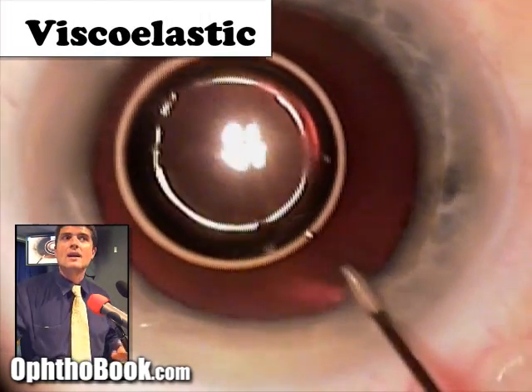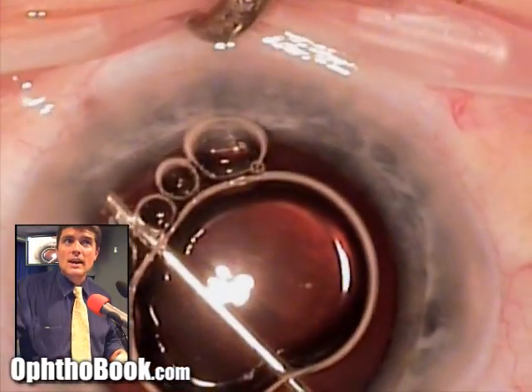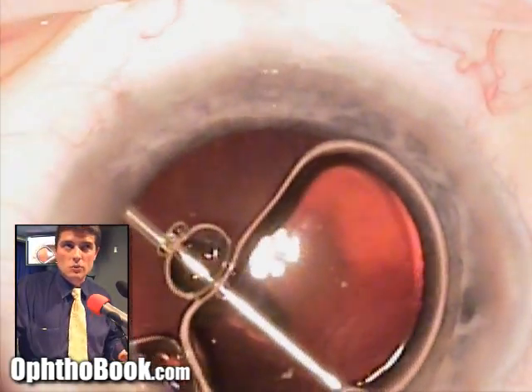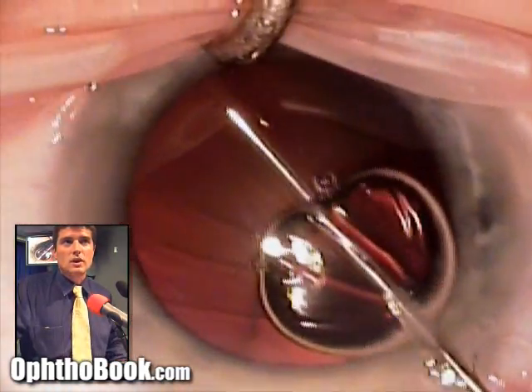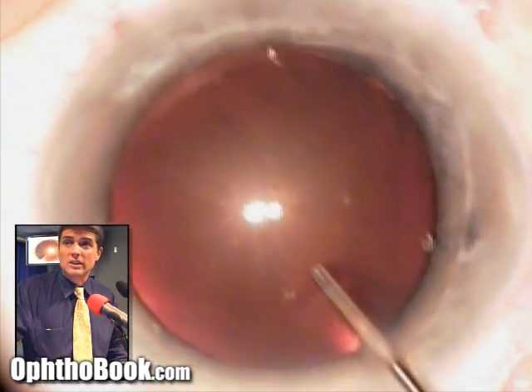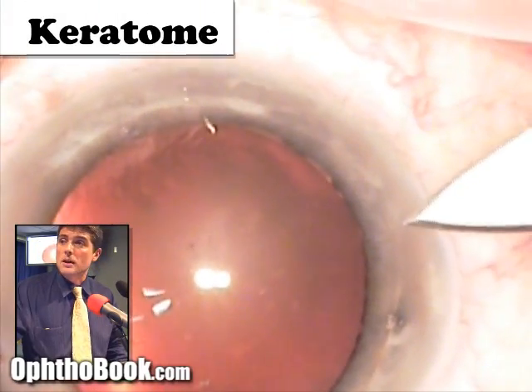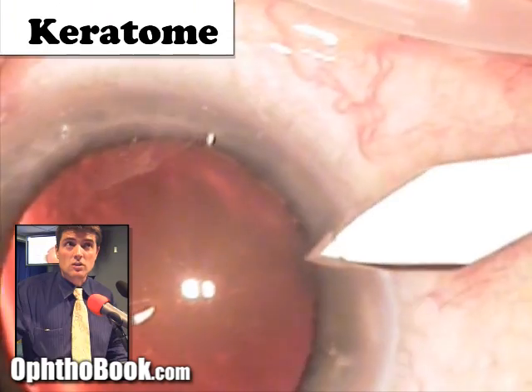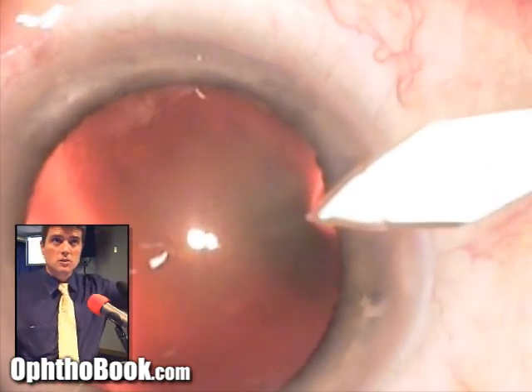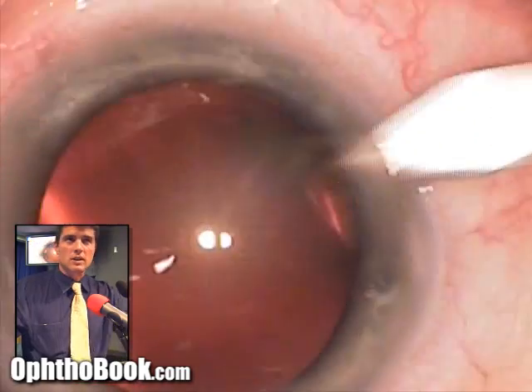We inject viscoelastic to protect the inner surface of the cornea from instruments and to make sure the eye doesn't deflate when we make the main incision. As we fill it up you can see it pushing the air bubble out and filling the eye — it's clear so it's hard to see, but it's there. Now we make our main keratome incision — we angle it so it's three-planar for a water-tight wound, and then we insert it.